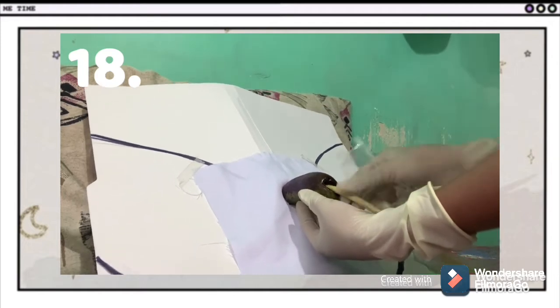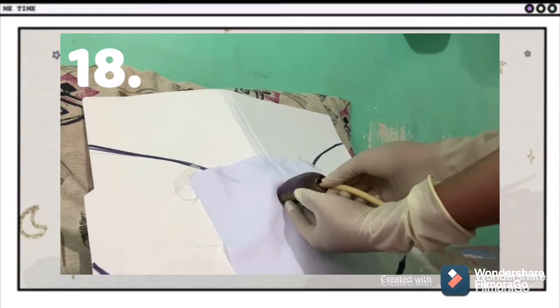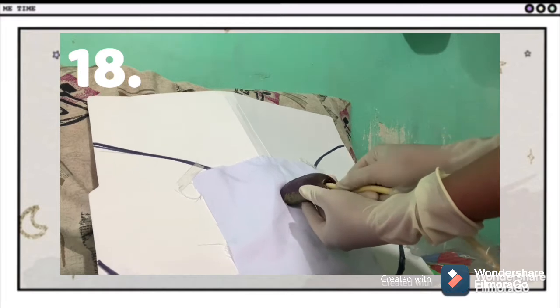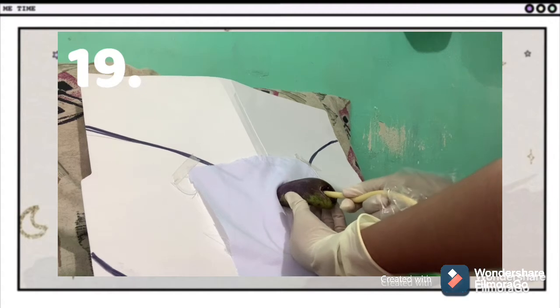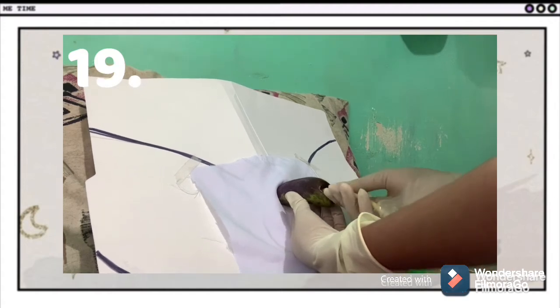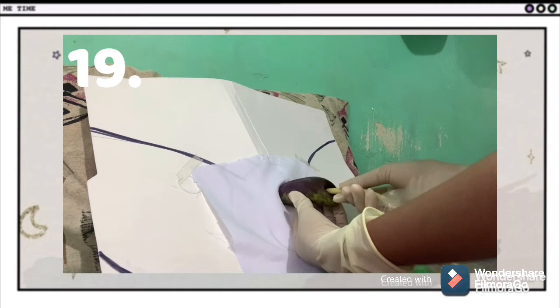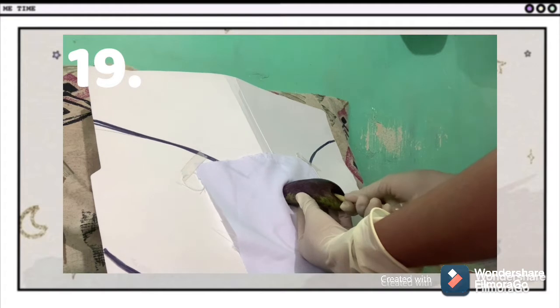Advancing an indwelling catheter an additional 1/2 inch to 1 inch ensures placement within the bladder and facilitates inflation of the balloon without damaging the urethra. Do not force the catheter through the urethra. Take a deep breath, sir. Ask the client to breathe deeply and rotate the catheter gently if slight resistance is met. The sphincter relaxes and the catheter can enter the bladder easily when the client relaxes.